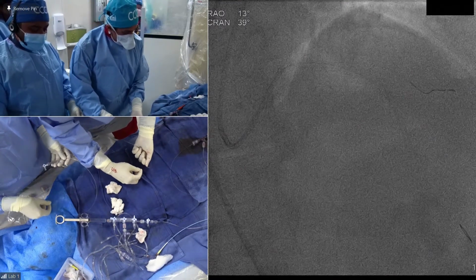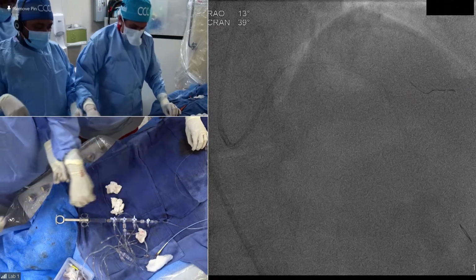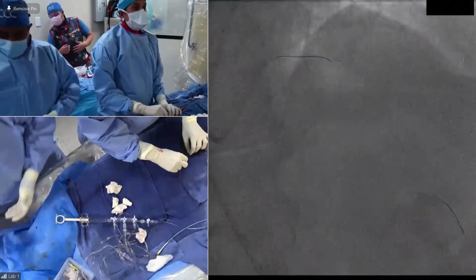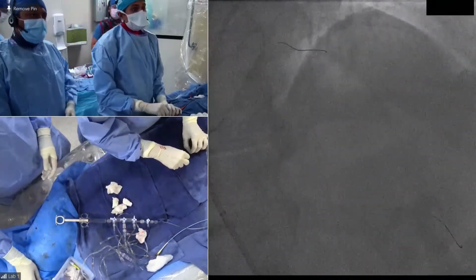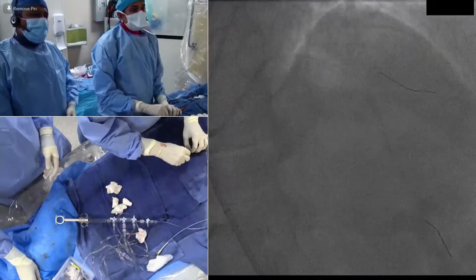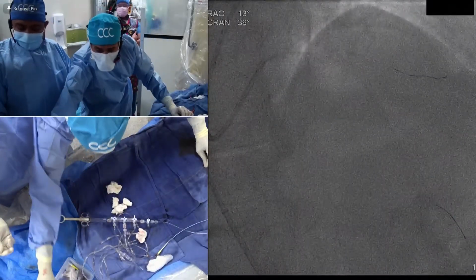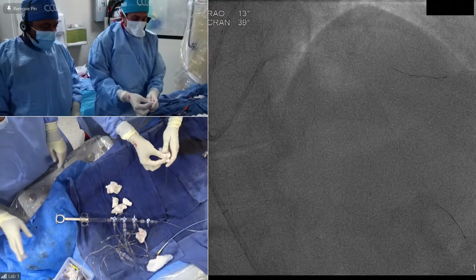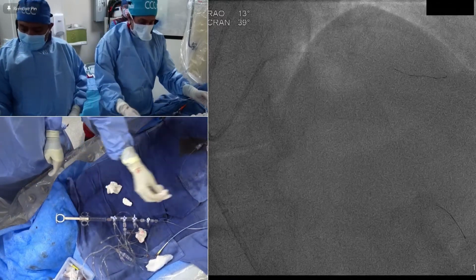Very difficult, indeed. Very difficult to disaster sometimes, particularly if you crisscross in the wrong way and you put a balloon and then you crush the stents even. This is a lot of crisscrosses here. But we continue to make this case extremely complicated by requiring Dr. Kini to keep recrossing into the side branch through the lumen. I know. You know why? The patient has a lot of tortuosity, groin tortuosity. Every wiring, everything is very hard here. Okay, give me the stents quickly.